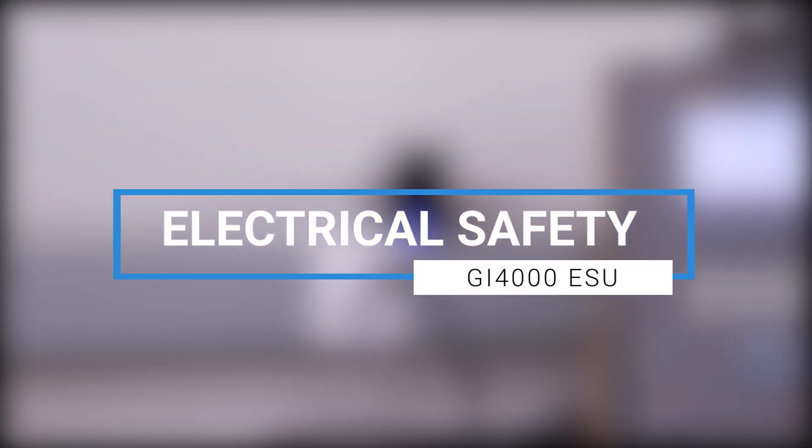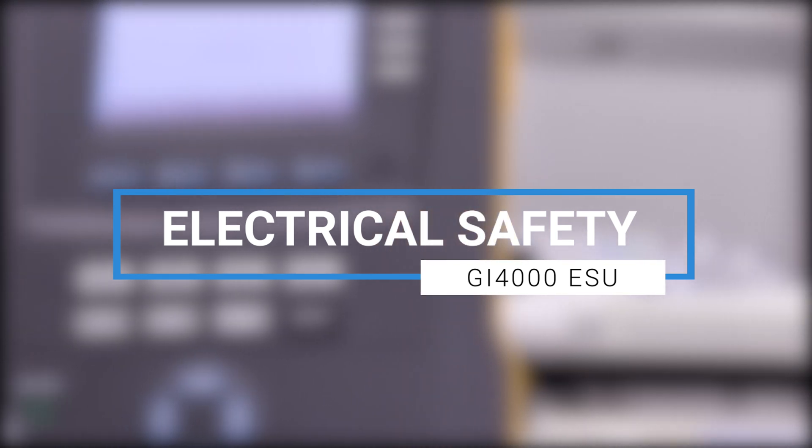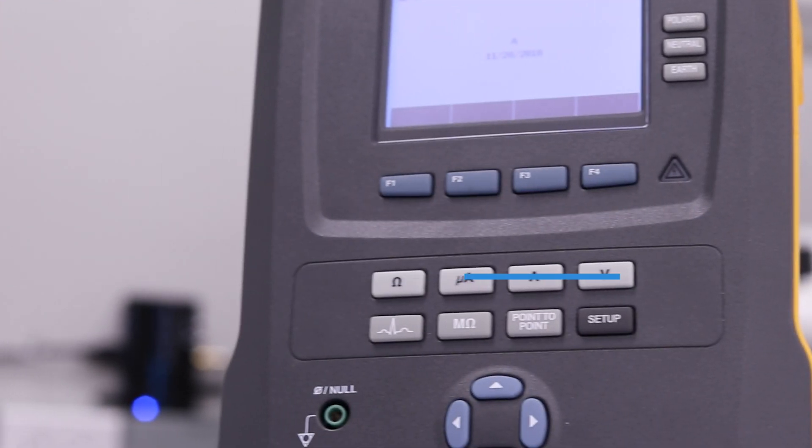Hello. Thanks for tuning in. In this video, we will be discussing electrical safety testing for the GI-4000 ESU.